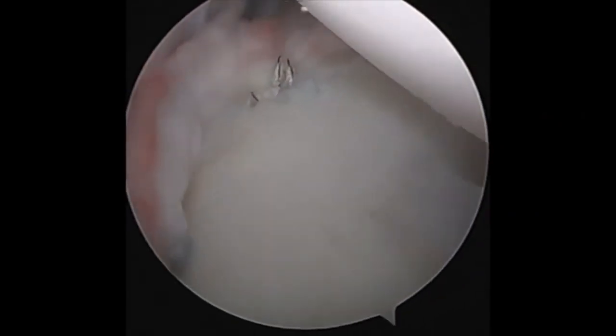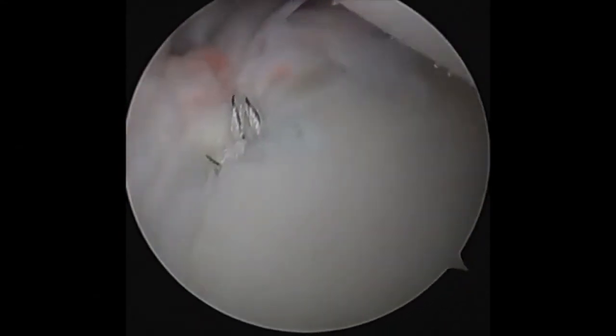And this is a 360-degree labral repair of the anterior-inferior labrum, posterior labrum, and superior labrum.